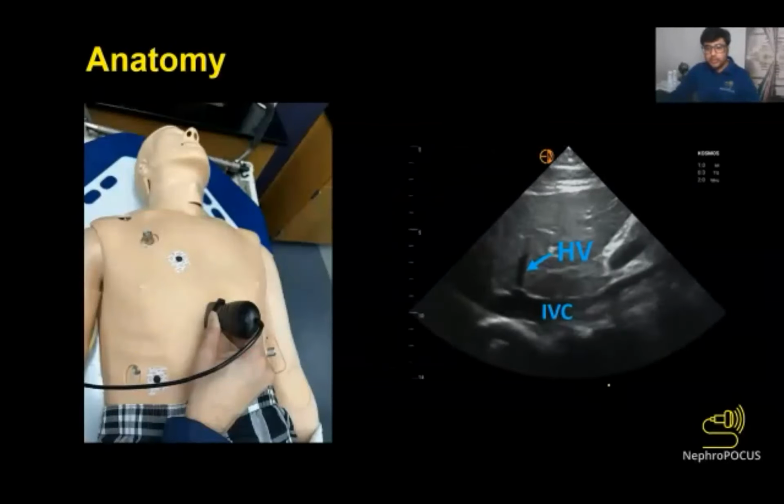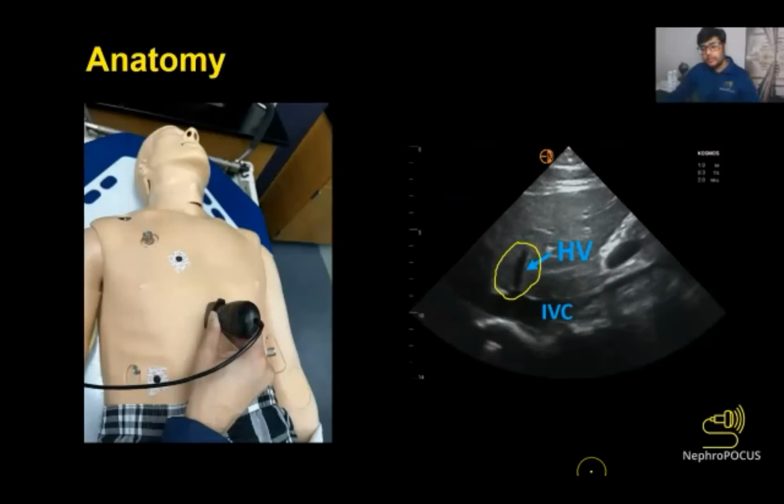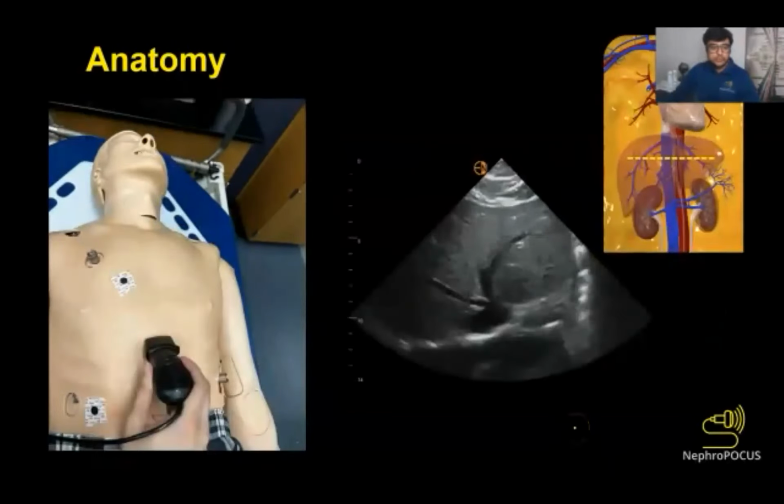And you can also access the hepatic vein from the traditional subxiphoid window where it joins the inferior vena cava. Usually it's the middle hepatic vein that's seen in this window. But in general, the Doppler waveform is much crisper when you do it from the right lateral aspect.